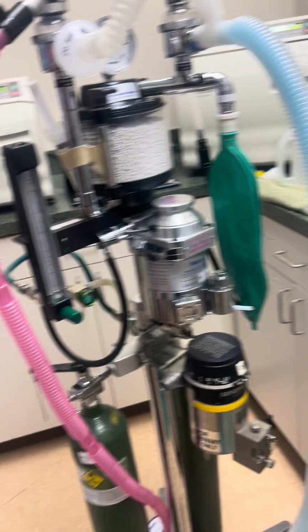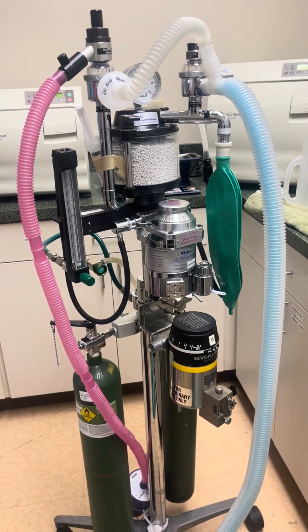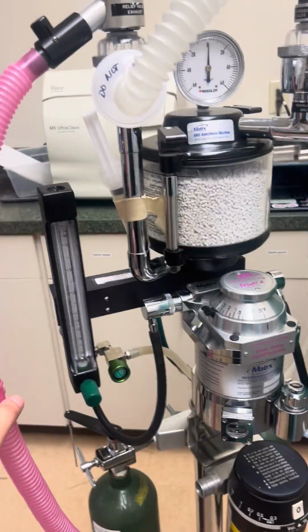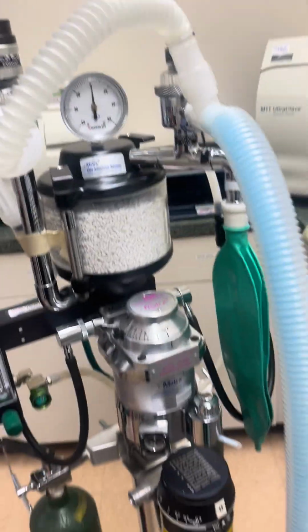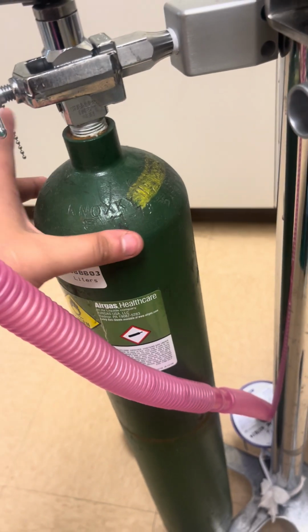Alright, today I'm going to be telling you about the anesthesia machine. Right now it's set up as a rebreathing system. So I'm just going to tell you about the parts of it and the order of flow of oxygen through it. So the first step is your oxygen.